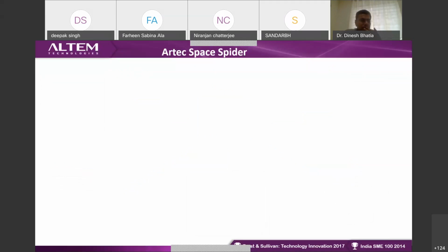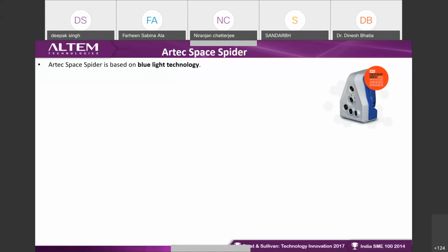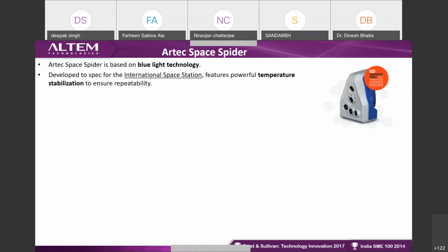Let me just explain a little bit about what 3D scanner we use for medical application. There's one piece of equipment called Artec Space Spider. There are different technologies involved in 3D scanning. How do we differentiate them? It is simply the light we use for projection. So there are blue light technology, white light technology, and laser based technology. Whatever kind of light you project becomes a different technology. The Space Spider I'm talking about was originally designed for NASA, where they use it on the International Space Station to digitize a part and then use it for 3D printing directly.